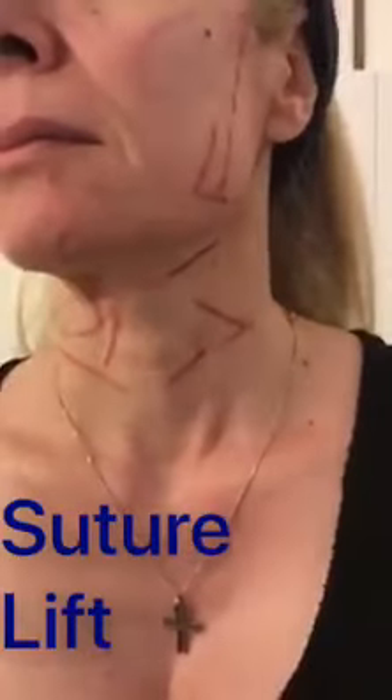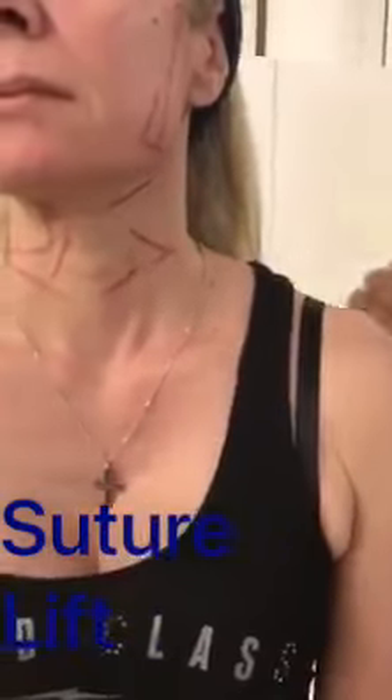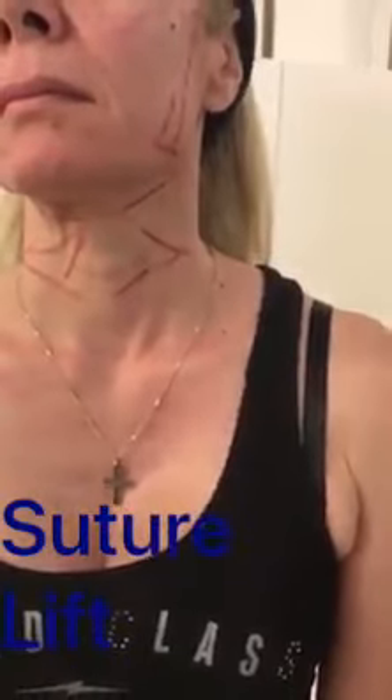You can see here the Happy Lifts that we will use today and we will come back with the final results. This technique is an office procedure; it has been done under local anesthesia, it takes about 20 minutes, and the patient can go back to work the same day.